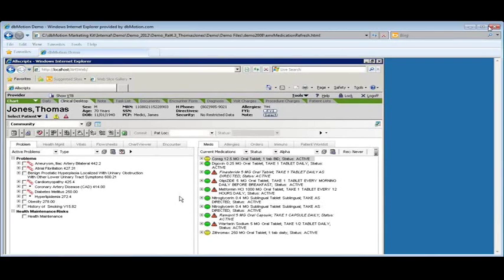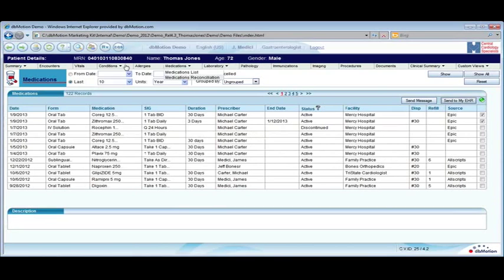So I just want to be real careful that when you see that one click and the magic of just moving a piece of data like that seamlessly, it does that really nice with Allscripts products, but not necessarily so well with some of the other EMRs. But our goal is to be obviously agnostic to all of them.